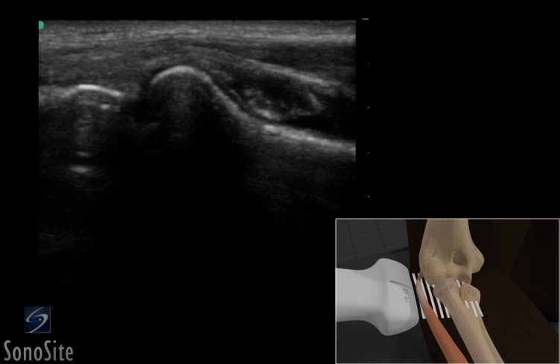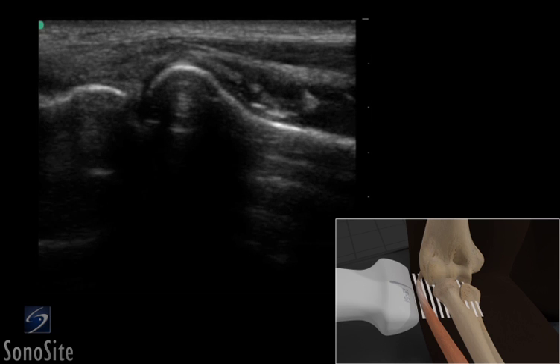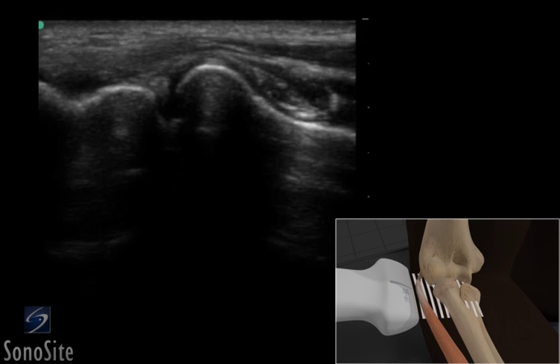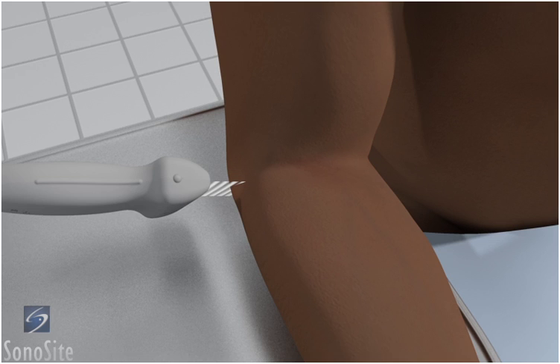A linear array transducer with a musculoskeletal exam type is used to perform an ultrasound examination of the lateral elbow. The patient is placed in a sitting position with the arm flexed 90 degrees and resting comfortably on the examination table.